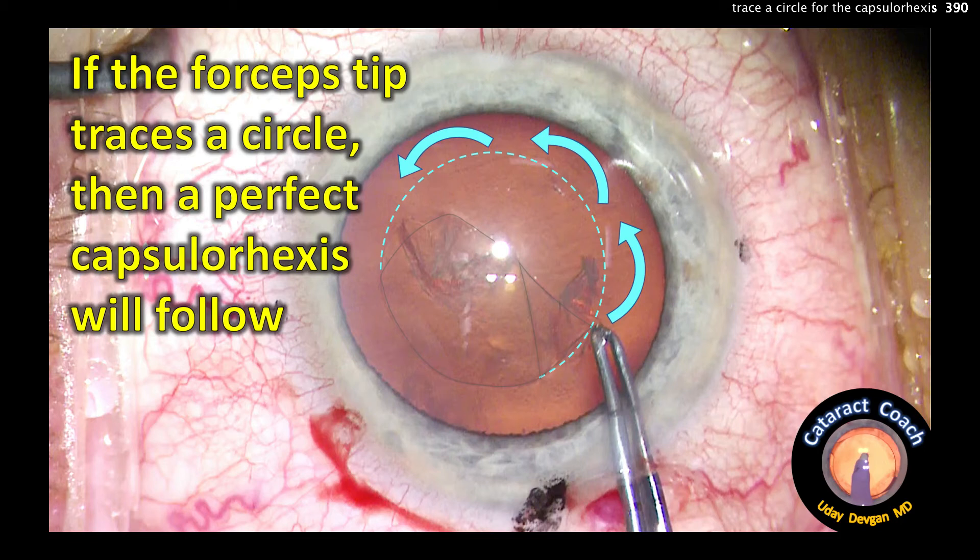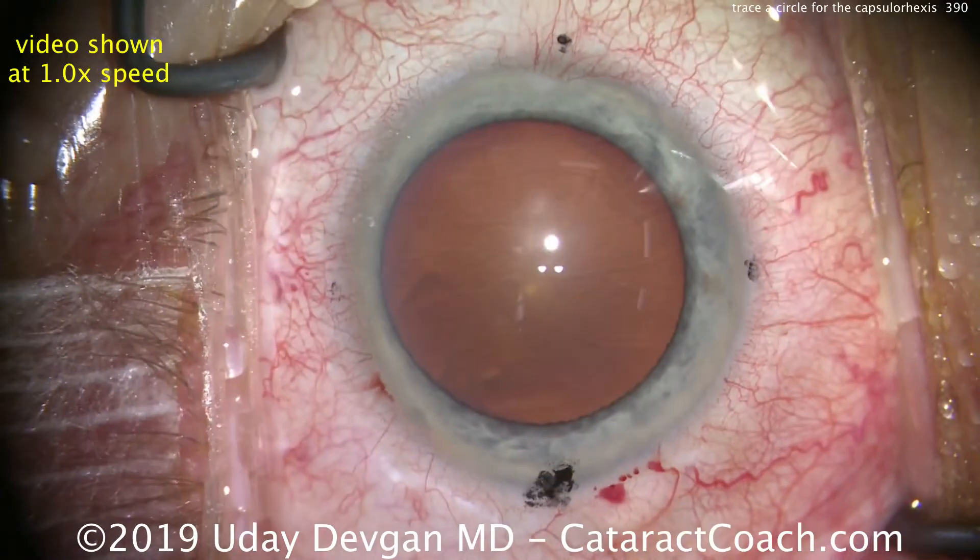CataractCoach.com. If the forceps tip traces a circle, then a perfect capsulorrhexis will follow. Let me show you.